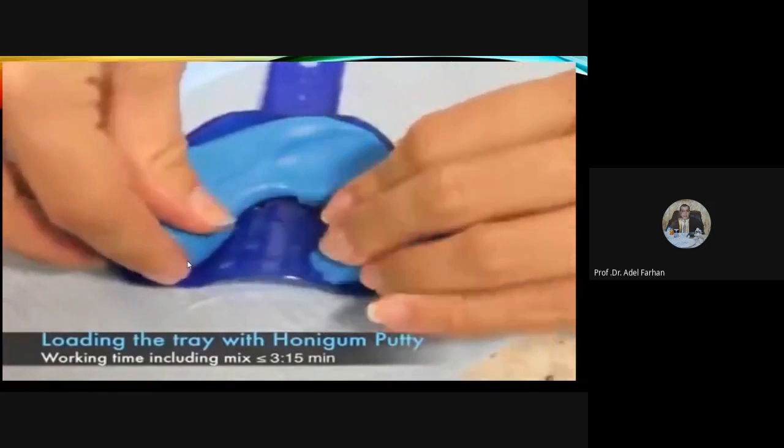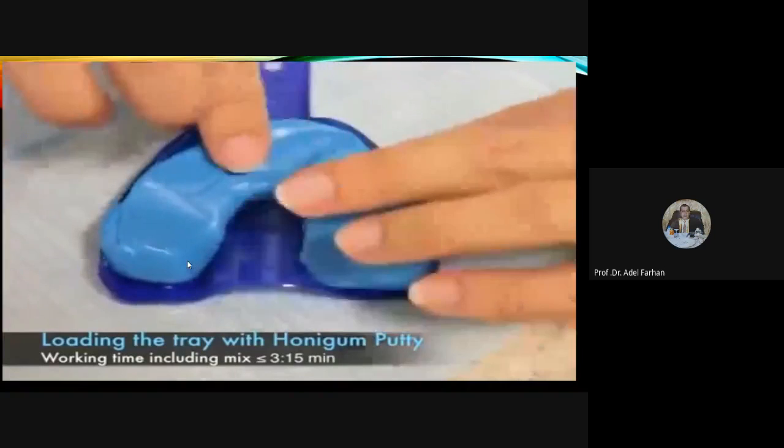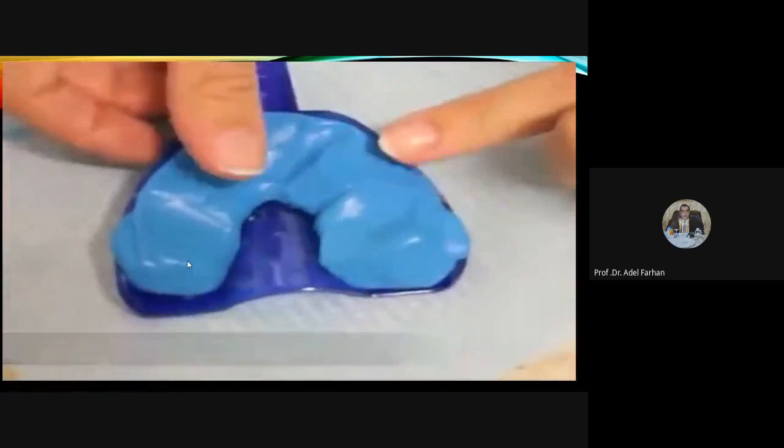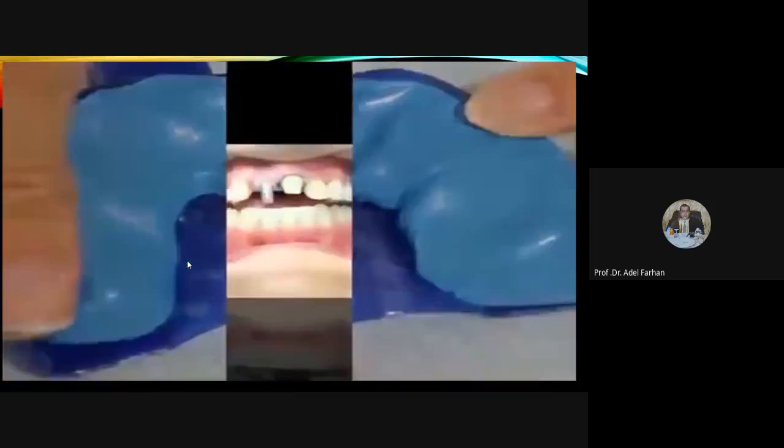اوكي احنا الان هذه سبيس باتي اند ووش تكنيك، يعني you have to create space for the light material.